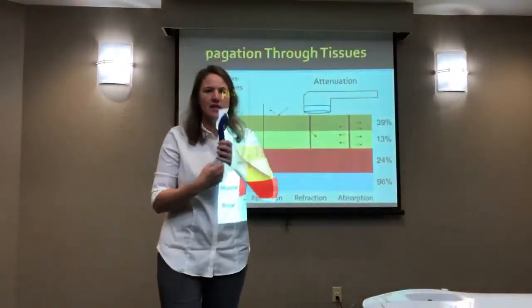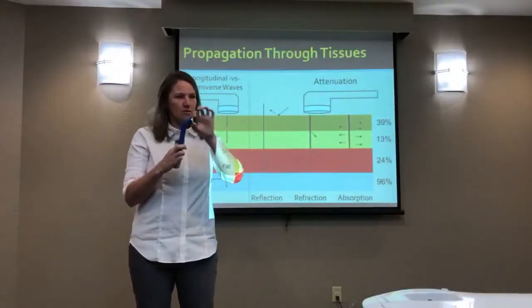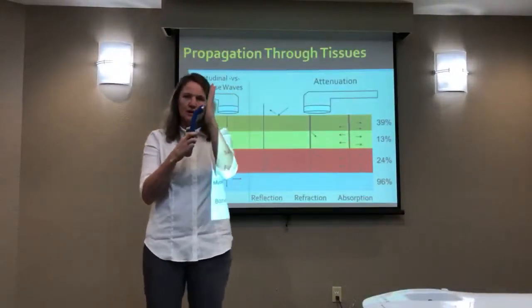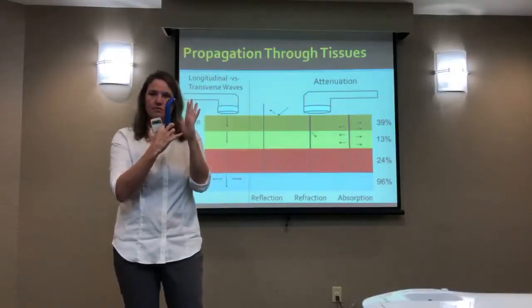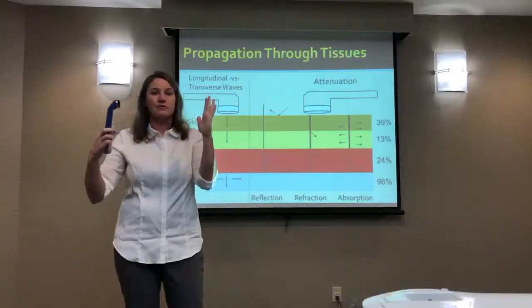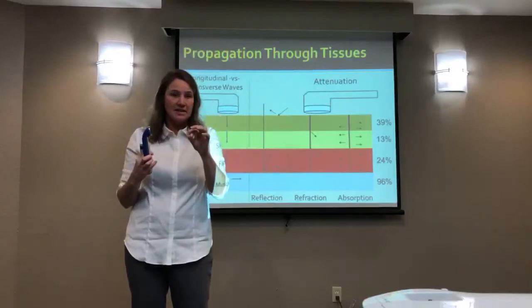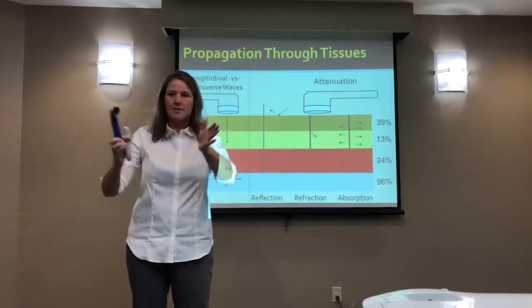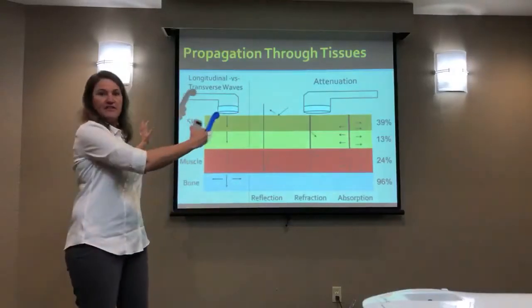So if you've got your ultrasound and you think of it as a flashlight, as it comes out, if you're shining that light directly on a surface, it's going to be pretty bright, and the area is going to be pretty synonymous with what's coming out. But if you start to pull it back and it goes further and further, this cone of light gets less dense, less sharp, and it becomes wider and wider, kind of like a projector, which is getting significantly bigger.